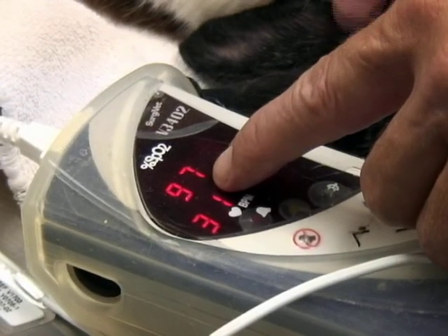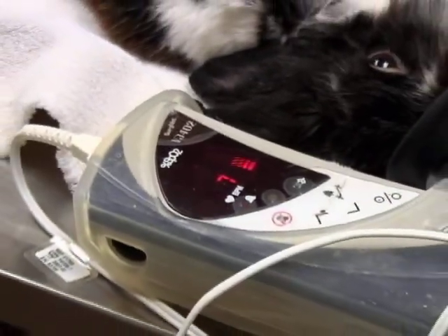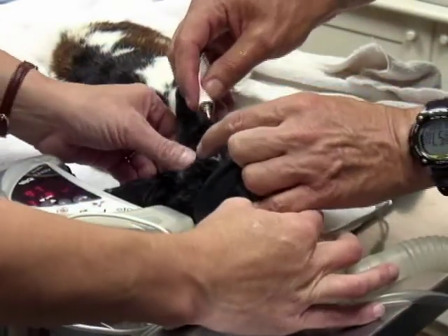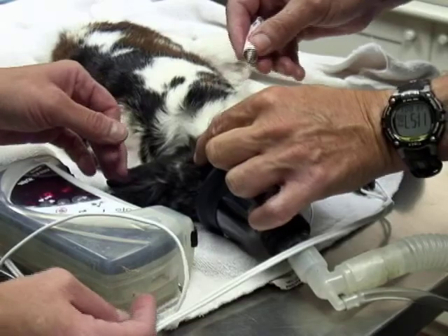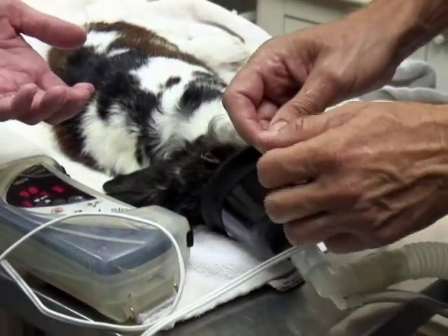We want to aspirate some joint fluid and see if we've got an active infection or inflammation in this joint. We're putting ointment in his eyes, because when they're anesthetized they don't necessarily close their eyes, so we put ointment in to protect the cornea so that it does not dry out.